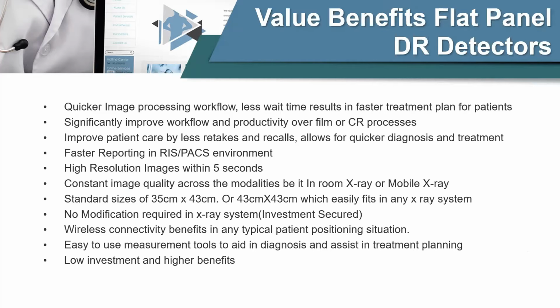So what are the benefits in DR? You have quicker image processing, and a significant improvement in workflow. Patients don't need to be taken out and in, so there are fewer problems for the patient. You don't need to recall the patient again. Faster reporting, as immediately the image is transferred into a PACS system where you can see the image immediately. High resolution images, and constant image quality. You maintain a constant image quality, it does not deteriorate. You get good quality images either in the X-ray room or on the mobile also.